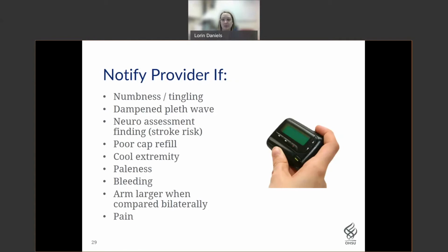That's definitely reportable. So let's take a minute and look at what the actual band looks like for the distal TR, because there is a special disposable for this. You can use a traditional TR for this, but especially at our facility, we are getting the specific band for the distal approach. So let's take a minute and look at that, see what it looks like, and then we will be about wrapped up.